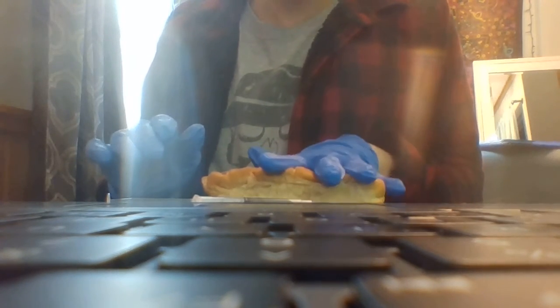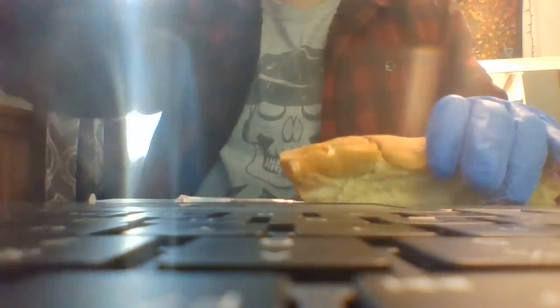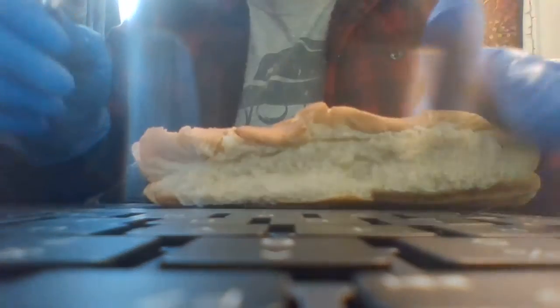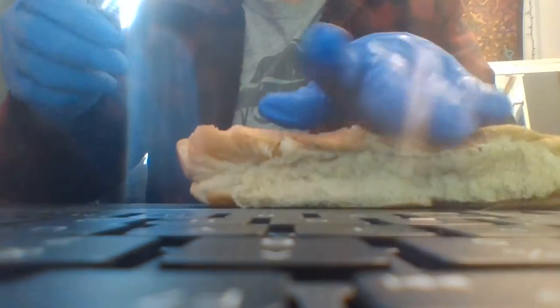Now I'm going to hold the skin taut like this. I hope you could see. Hold it taut like that. Ew, I'm getting crumbs everywhere. Okay, taut like this.